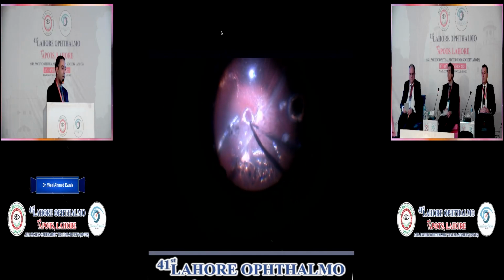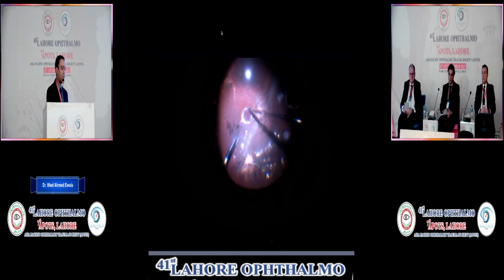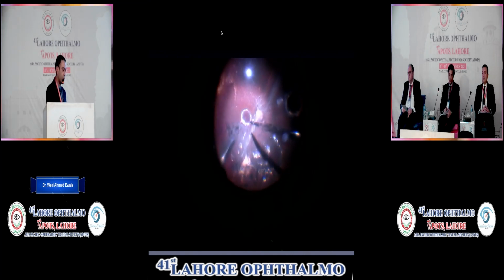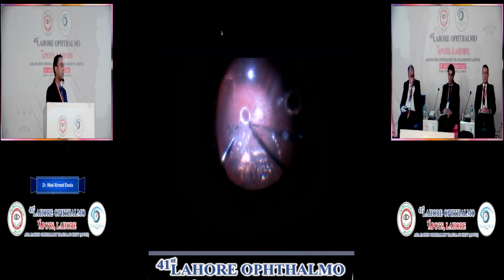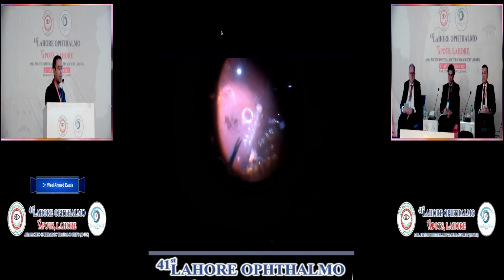But anyway, I had the target. I want to close the macular hole, whatever the price. I am now inside the vitreous cavity, and I have to find a solution. I placed the autologous graft in place, and by the end, I inject silicone oil under air.